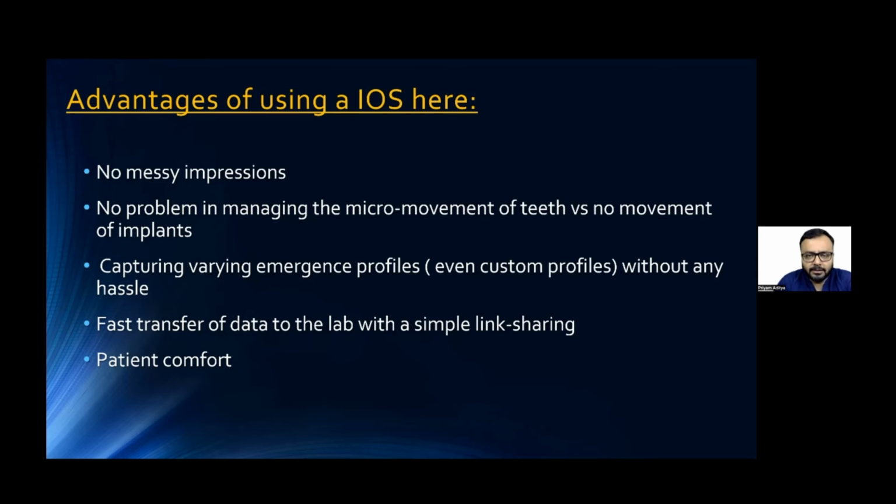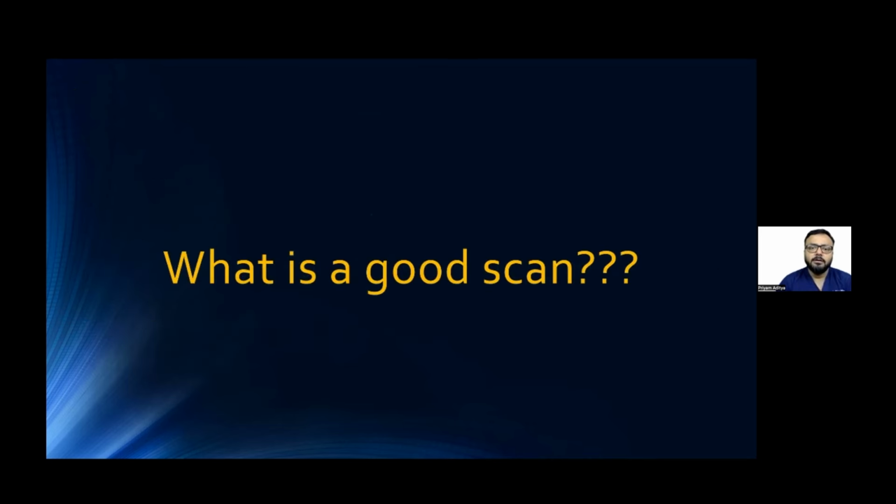You can simply just send a link to the lab and the data gets transferred immediately. And most important of all, your patient is super comfortable. So this is how we are working now. But when we talk about scan, there has to be some reference point, there has to be some basic properties that has to be there in a good scan to say it's a good or acceptable scan for the work. Not every scan can be a good scan.